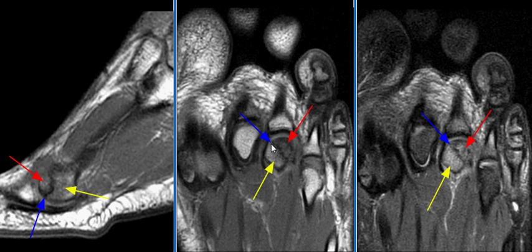There is mild irregularity of the volar aspect of the subchondral plate of the metatarsal head. Also noted is irregularity of the distal cortex of the third metatarsal, which may represent a subacute fracture. MR findings are compatible with Freiberg's infarction.